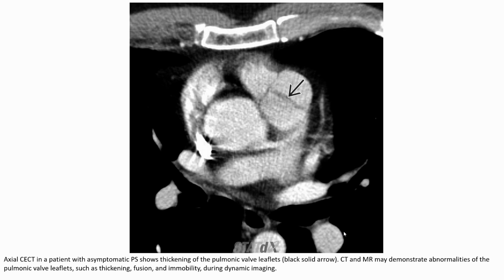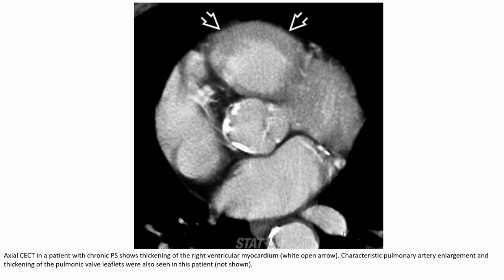The CT of a patient with asymptomatic pulmonary stenosis demonstrates thickening of the pulmonary valve leaflets. CT of the pulmonary valve may demonstrate thickening of the pulmonary valve leaflets and immobility during dynamic imaging. The CT image shows thickening of the right ventricular myocardium, characteristic pulmonary artery enlargement, and thickening of the pulmonary valve leaflets.